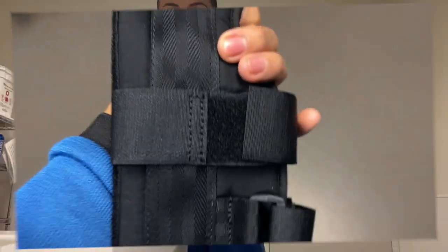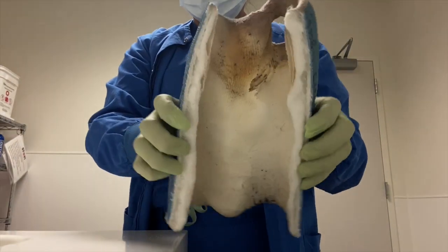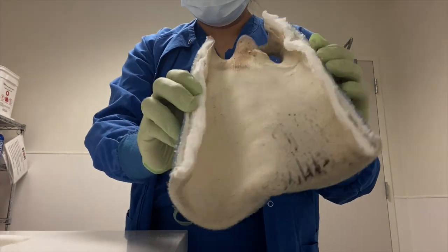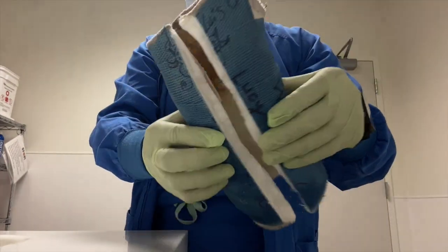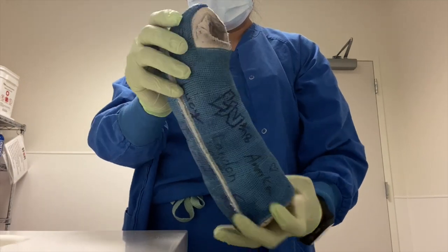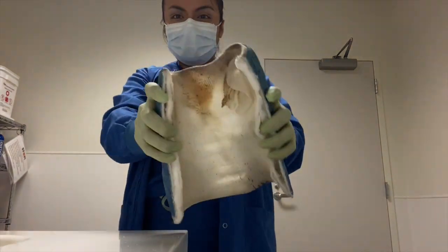Up next we have this short arm cast that I removed on a patient who had a soccer injury. Thankfully the patient didn't want to keep the cast because it was just so dirty, and they actually went back into a wrist brace. A wrist brace is actually better than a cast because you can remove it when showering.